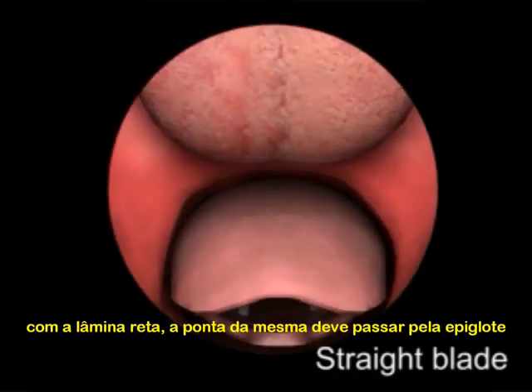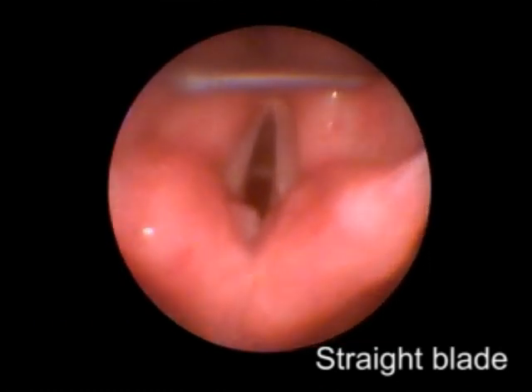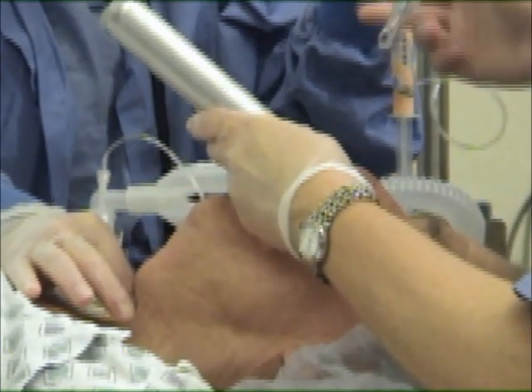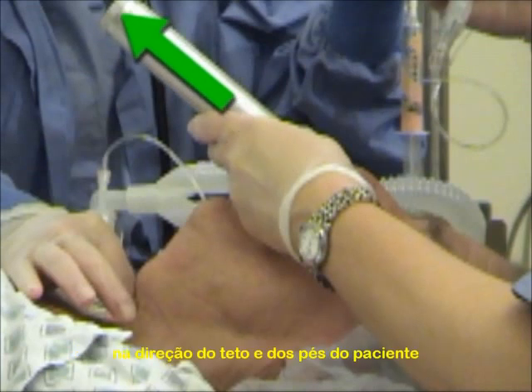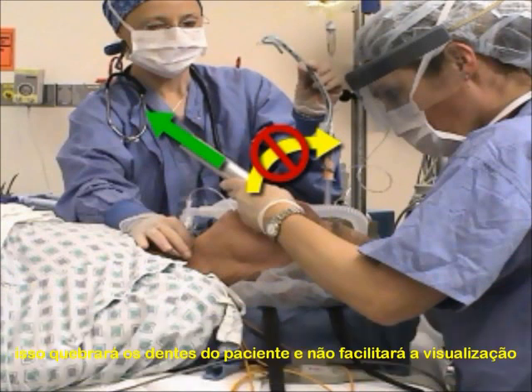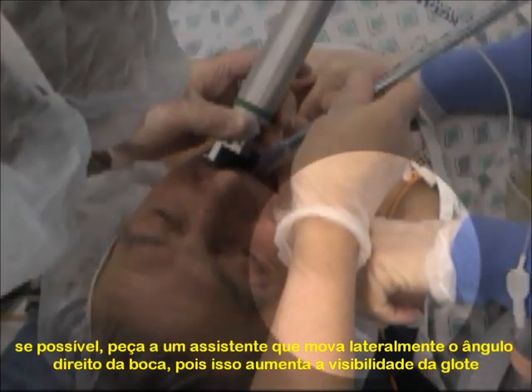When using a straight blade, place the tip of the blade just past the epiglottis and lift anteriorly to expose the vocal cords. When the tip of the blade is correctly positioned, lift the laryngoscope upwards and forwards at a 45 degree angle. Direct the force of your lift along the axis of the laryngoscope handle in the direction of the ceiling over the patient's feet. Avoid bending your wrist or rocking the blade against the patient's teeth, which can result in dental or soft tissue injury and will not enhance the view of the glottis. If available, an assistant should gently pull on the right side of the cheek to enhance visibility of the glottis.